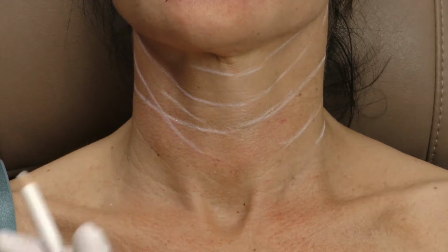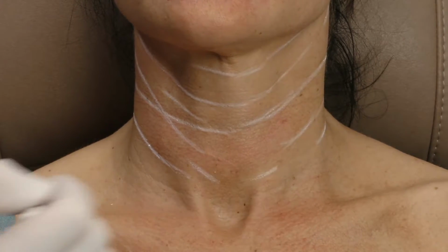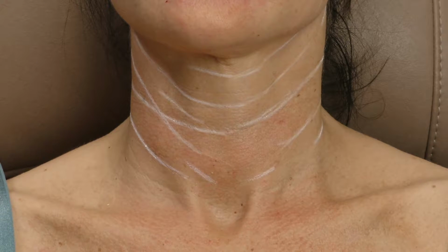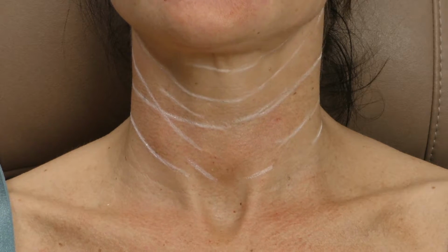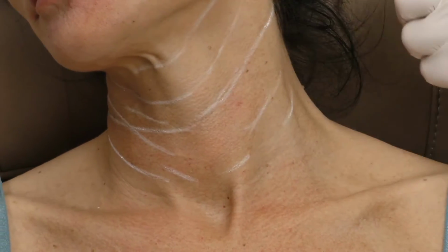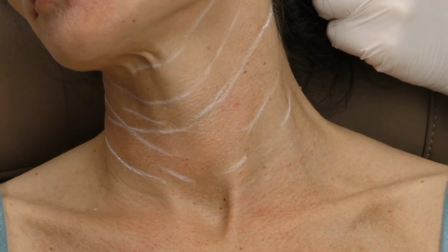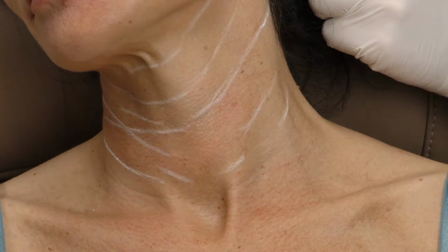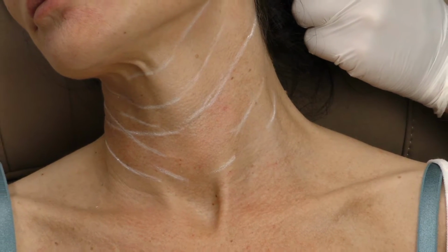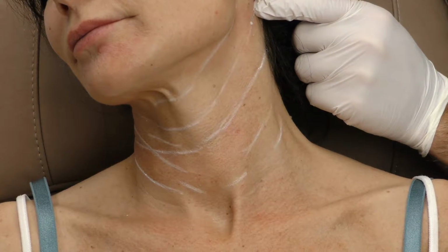So this is a very, let's say, basic technique, retrograde linear threads with a 27 gauge needle. And I'm just using the needle that was supplied in the package. It is the 27 gauge 2 centimeter needle. So I'm going to go ahead and start the treatment. I put in the needle from here. I stay very superficial, so it's basically 1.5 millimeters below the surface of the skin, and inject small amounts, 0.05, something like that.